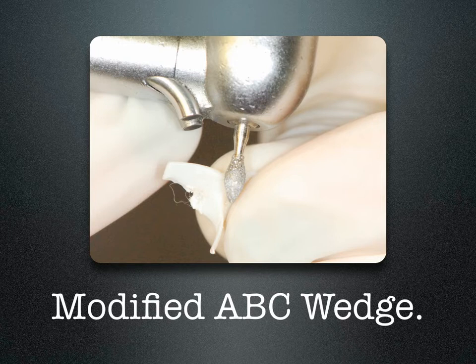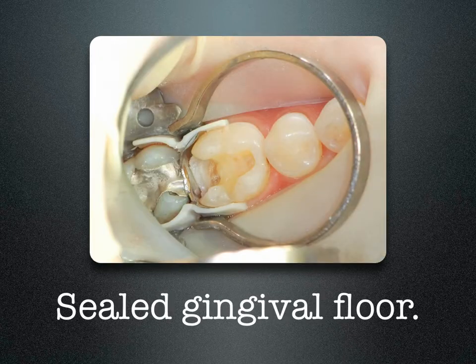I'll need to modify an ABC wedge to restore this tooth. ABC wedges are used from the buccal and the lingual. By using them in pairs, they work against each other, sealing off the gingival floor. The wings of the wedge support the matrix band, preventing the separating ring from crushing the band into the box.